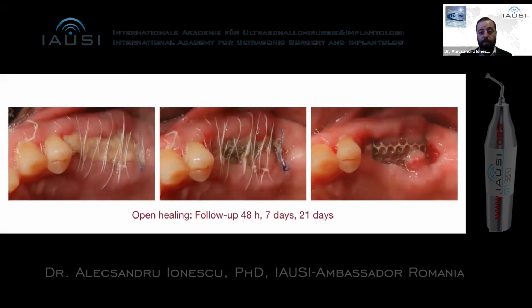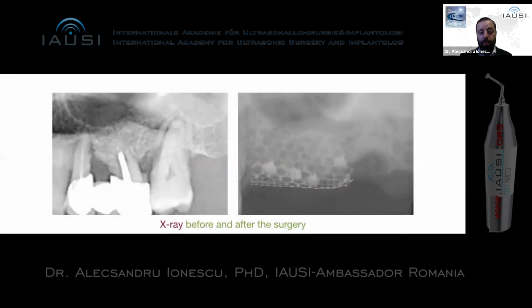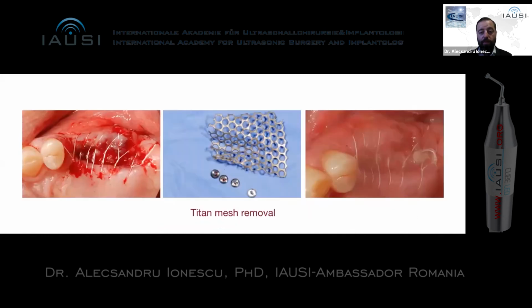And this is how the crest is healing after 2 days, 7 days, and 3 weeks. And then we decided to leave the titanium mesh there for 6 months. Of course, if the titanium mesh is moving during this period, you need to take it out because it's affecting the healing. So this is where we started and the situation after the surgery.